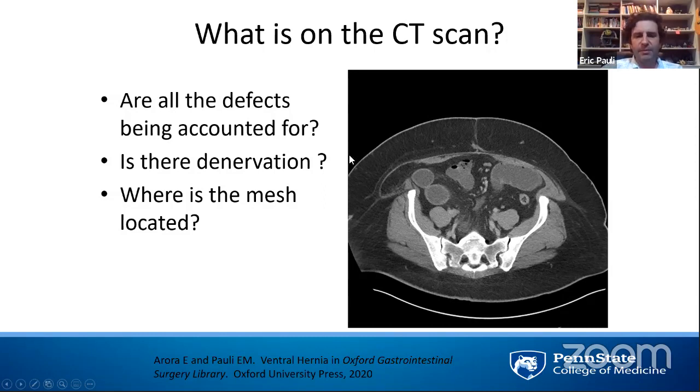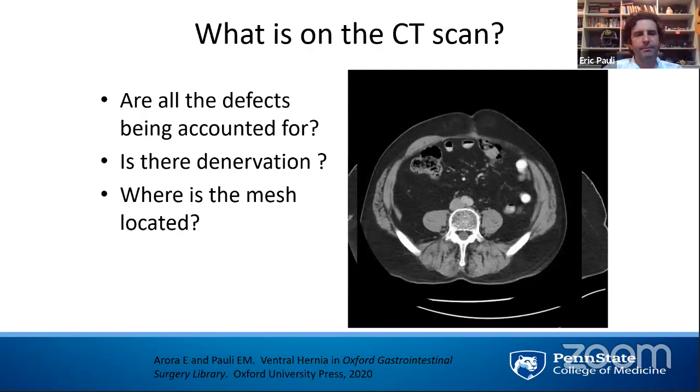The problem is, if you miss this lateral hernia and you don't fix it, this person's gonna come back and say, hey doc, the stuff in the middle, great. What's this bulge on the side, and when are we gonna fix that, okay? And this obviously changes how much dissection you have to do and where you have to do it, because this abuts the ASIS, as you can see.